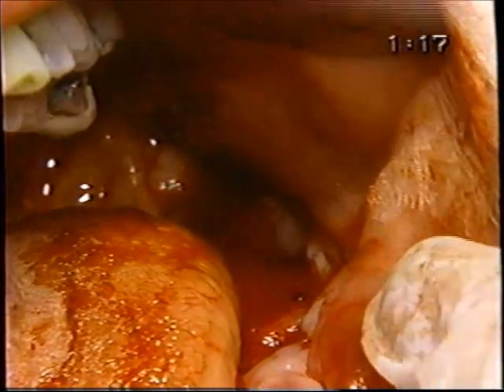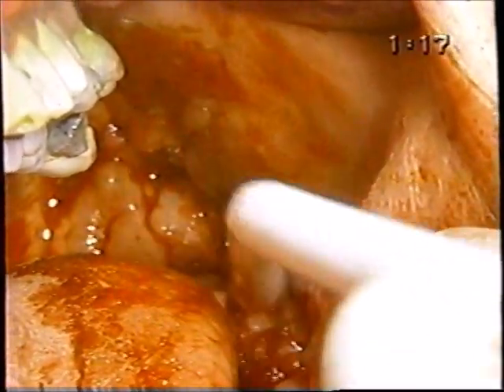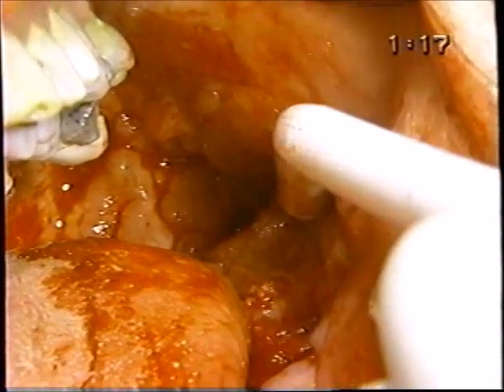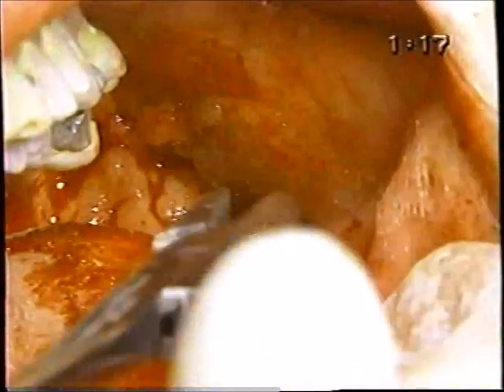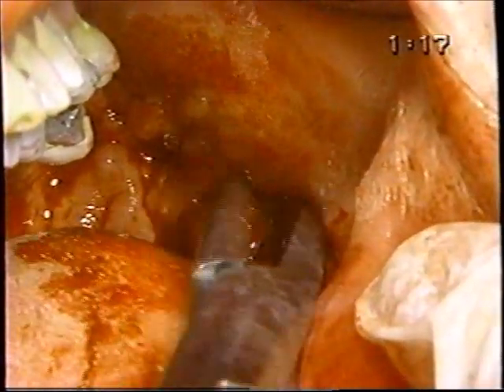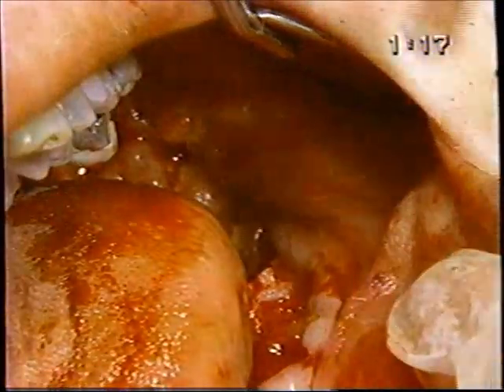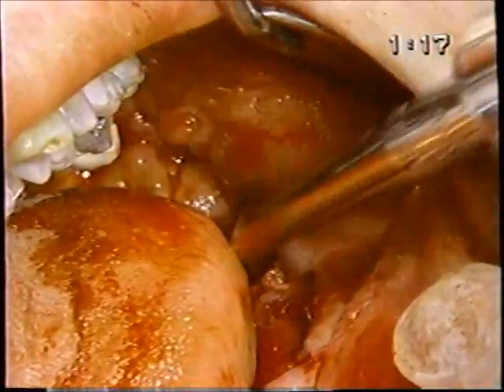Okay, let's grab the suction. Give me a needle holder. Of course, if we get one of them out, then we're home free because we have an empty socket in which to use one of those instruments like the crier to get the other one out. Looks like that's just one of them. Yes, I can see another root back there. We'll use that same instrument, this time in the socket. And there it is. Okay.